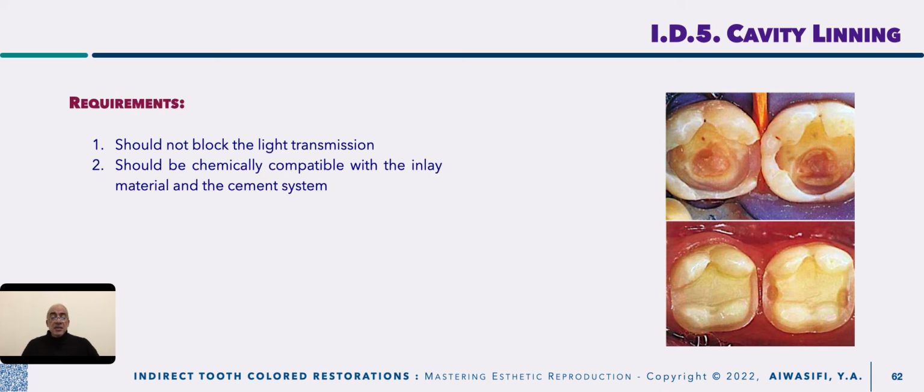Okay, that's why the material you used should not block the light transmission, because you will use a light-cured or dual-cured adhesive resin cement, and it should be chemically compatible with the inlay material and the cement system.